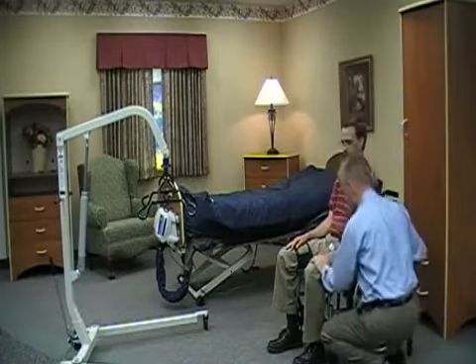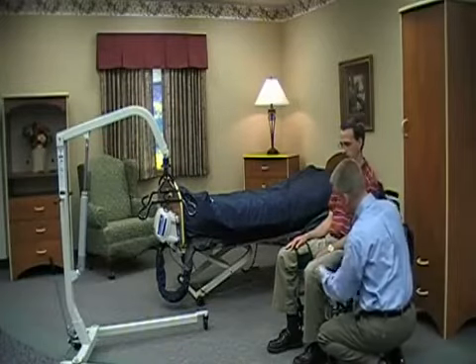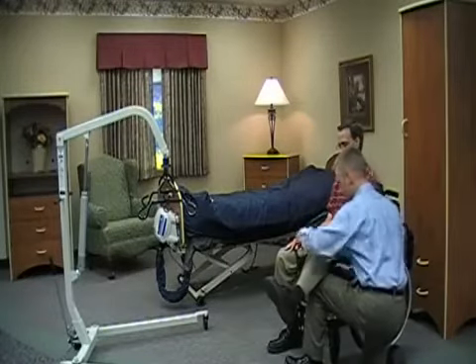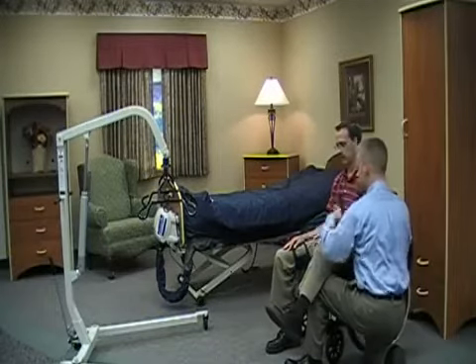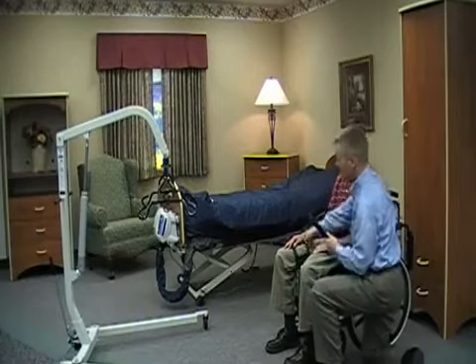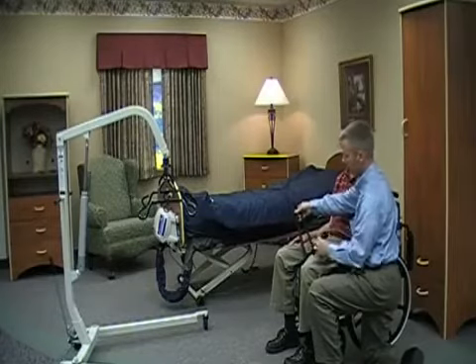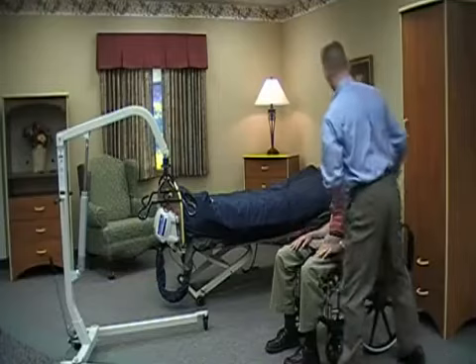For the left side, you'll see the same thing. I'm going to draw that strap down, ensuring that it's in the proper place, and I'm going to either lift the resident's foot up on top of my foot, or their leg up on top of my leg to create that gap so that I can draw the strap down through. I'm going to use the edge of my hand to ensure that it's moving through without friction. Then I'm going to take these two leg straps and cross one through the other — in this instance left through right — and draw them down snugly. That's to ensure proper fit for the resident's safety.